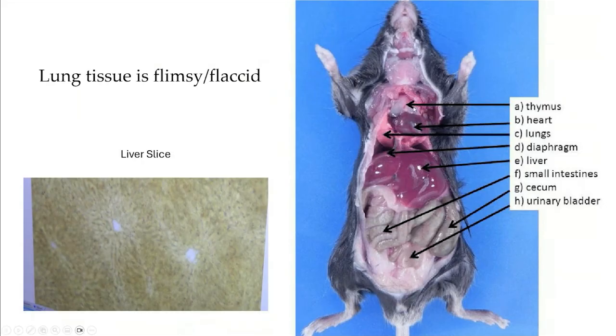You'll have a beating heart, so you'll have to remove the heart, and then you will cut away this extraneous tissue and fascia above the trachea to completely expose the trachea. So the trachea will have to be cleaned of fascia and be exposed.